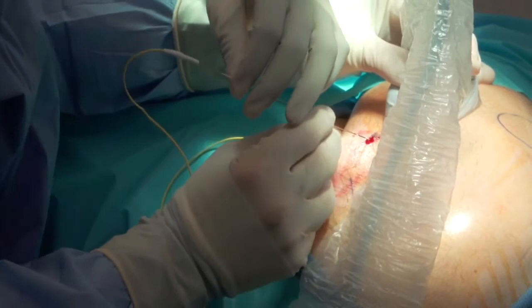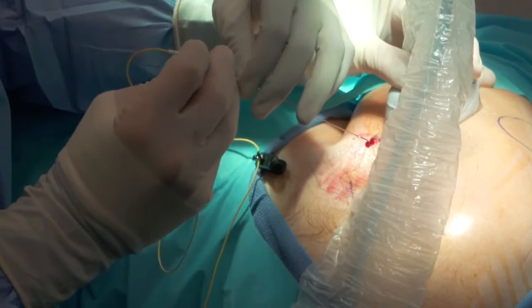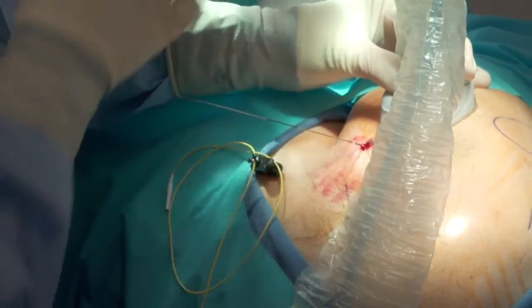You feeling your arm move there? I got a really nice motor contraction here. 0.7. Great. Perfect. All right, so we're going to disconnect this, and make sure that nothing moves now. So what I'm going to do at this point is get the dilator.